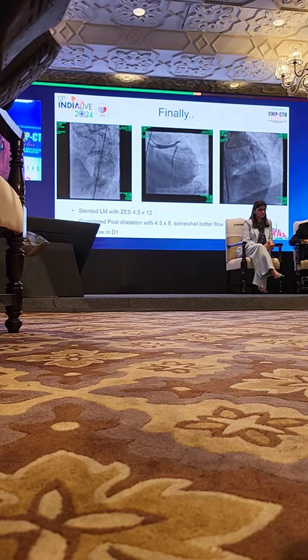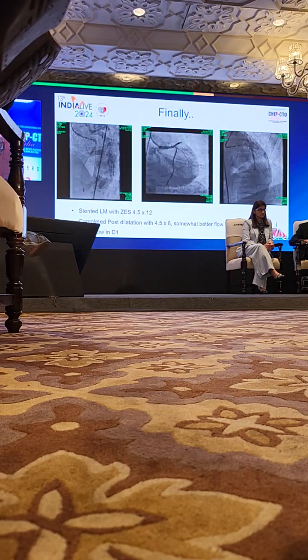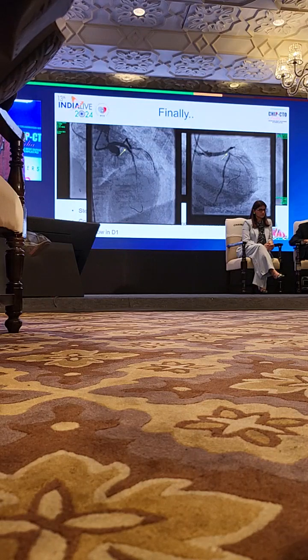There are two things that were visible here. You can see that in the right view there, we can see there is some under expansion of the LAD stent over there at the LM-LAD ostium complex. It was also balanced by the haziness in the circ over there. So we decided to stop here for the day with respect to the coronary work, and we decided to call her 2 days later after she settles down.